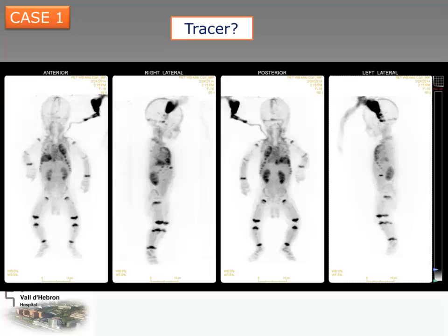This is the PET image obtained just after the fluorine injection. Okay? I think it was 3 or 4 beds and 1 minute per bed without CT. That means that we have obtained all these images during the 5 minutes after the fluorine injection. It's like a blood pool image of a bone scan.